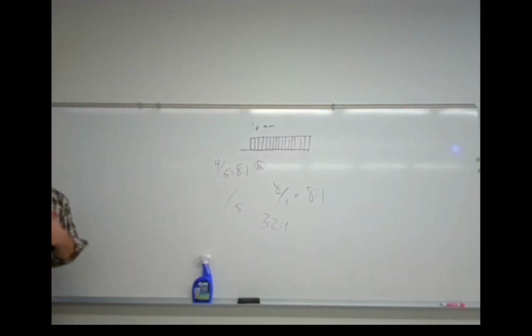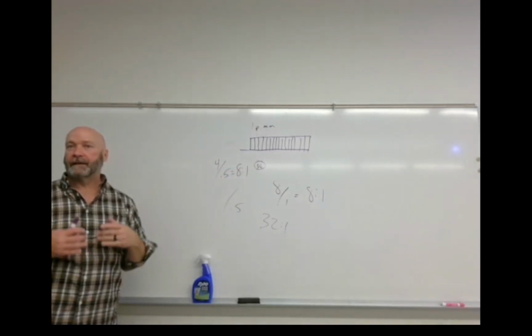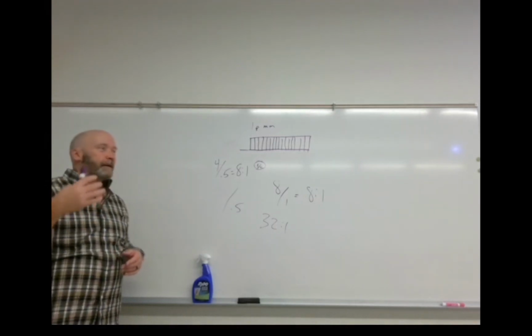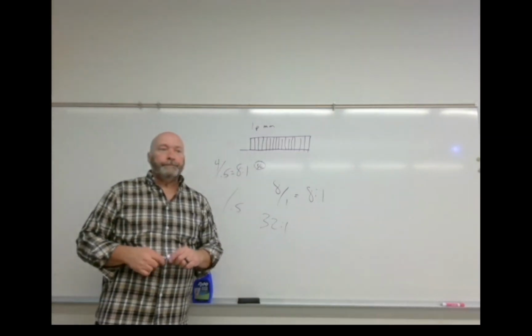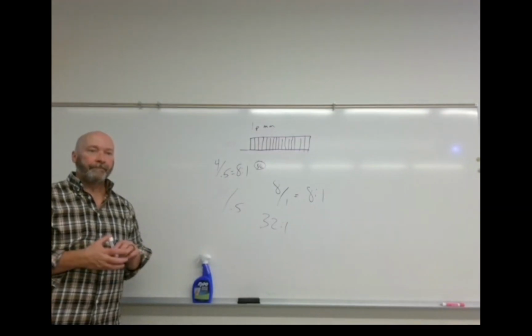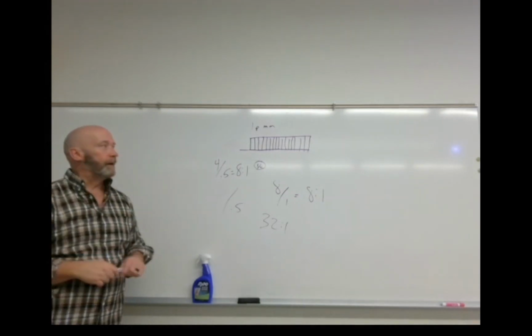Okay, so what changed between those two? We still have an 8 to 1 grid, so theoretically that level of effectiveness remains the same. So the amount of cleanup should remain the same. Contrast improvement factor should remain the same as well. But what changed? You just kind of replace the height of your grid with how many strips you have. Right, doubled the number of strips and reduce the height.